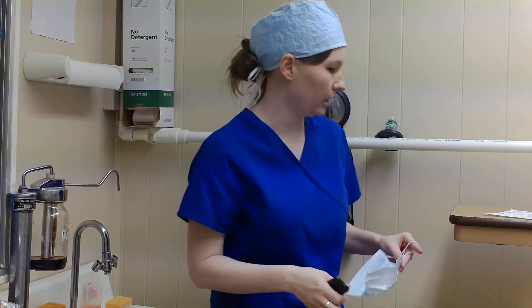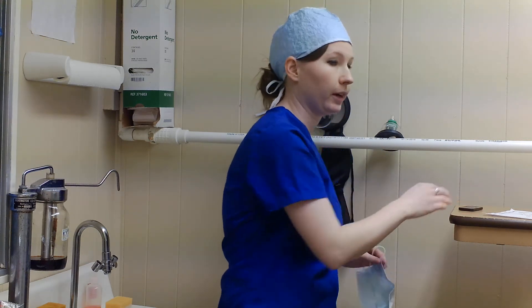Alright, this is me performing my surgical scrub. I'm going to go ahead and put my mask on.